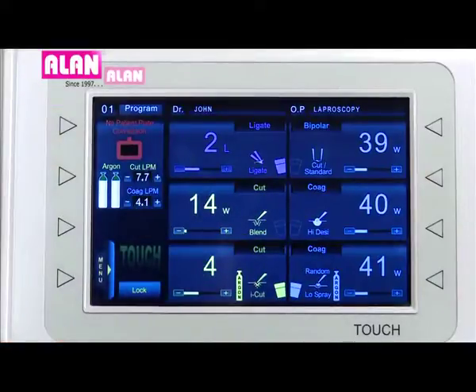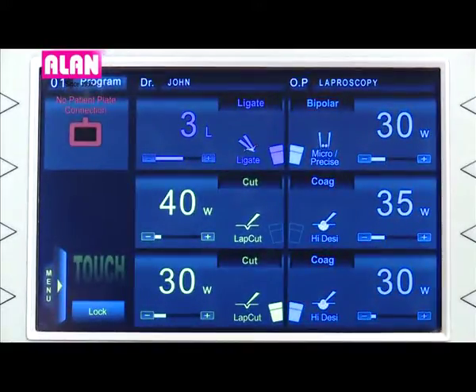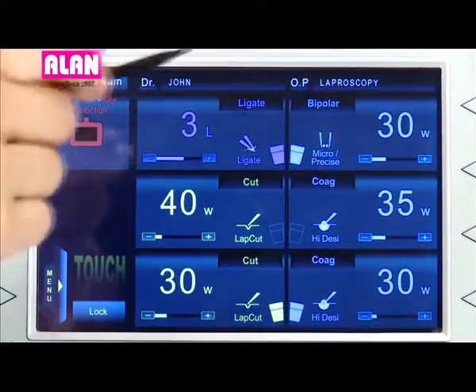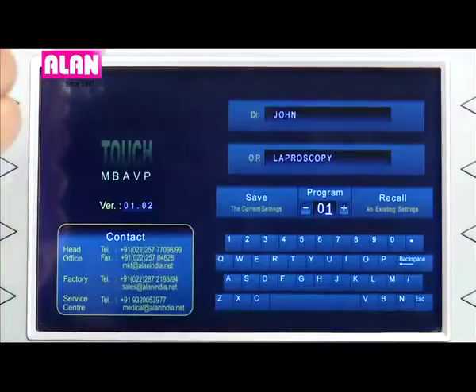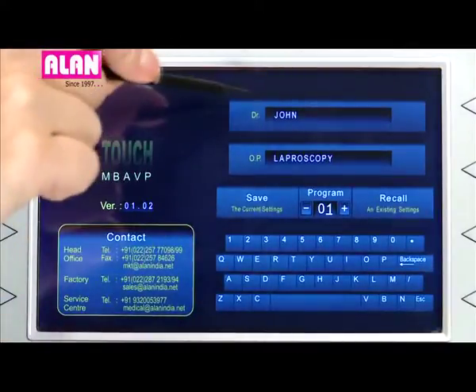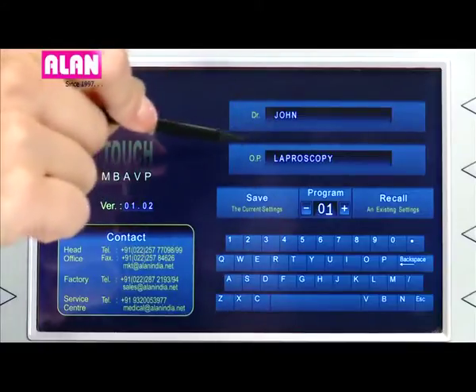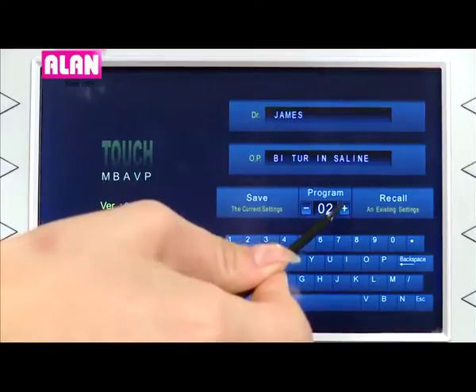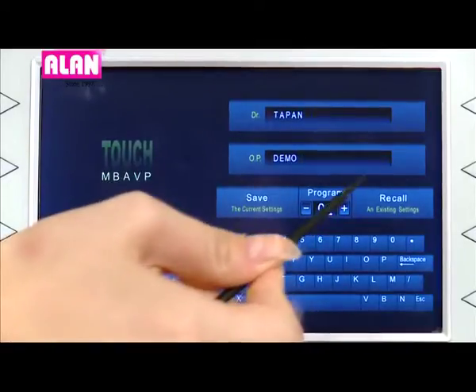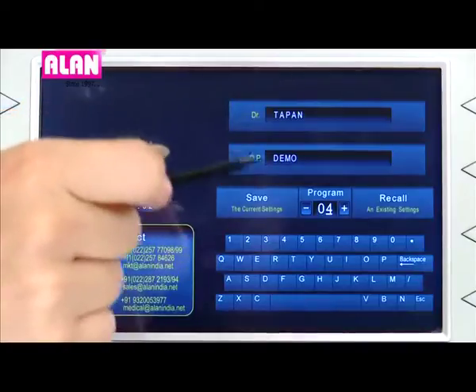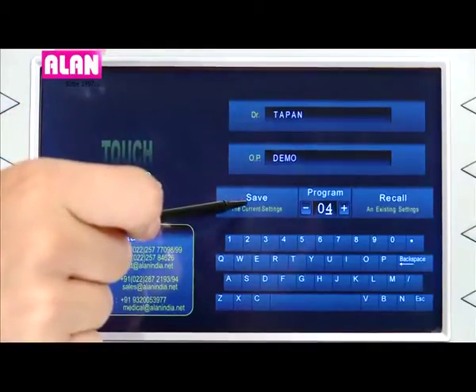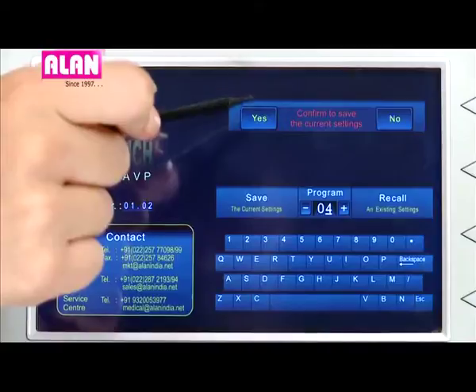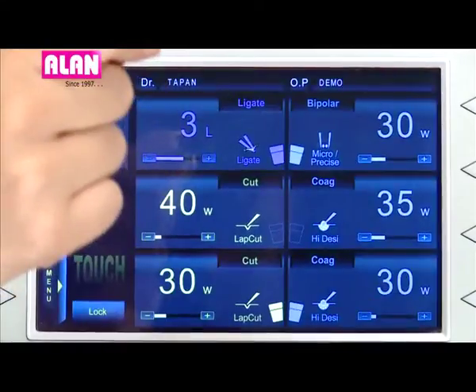The unit comes with 99 user-settable profiles. The user can store the current settings into any desired program number. To save to program 4, select the program number, enter the doctor's and procedure name, then touch and hold the save icon for a couple of seconds and touch Yes for confirmation.